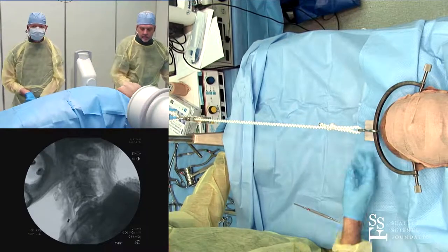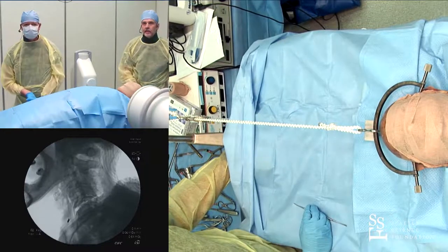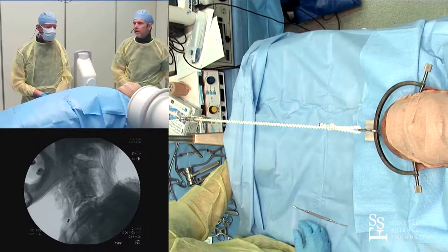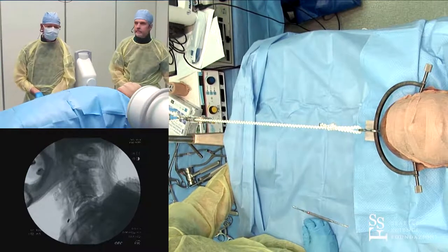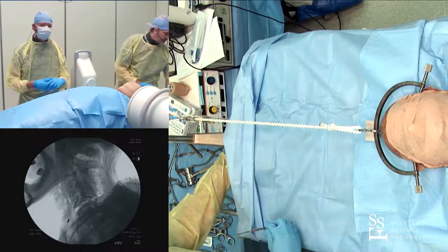Before we continue, does anyone have questions about tong application? People have talked about moving the tongs forward or backward to try to obtain a flexion moment or to unlock the facets. But I tend to put them right in line with the spine, the same as Andrew does.